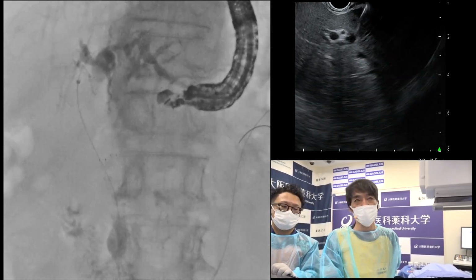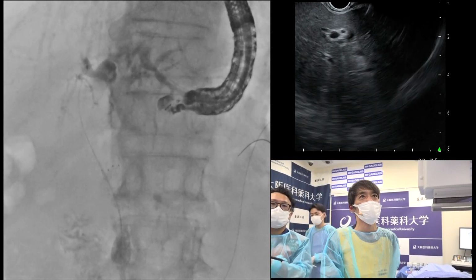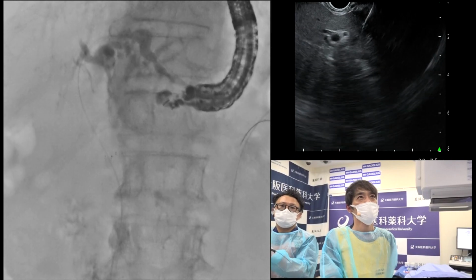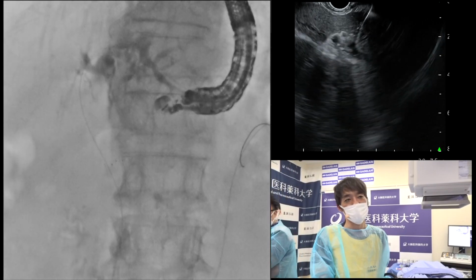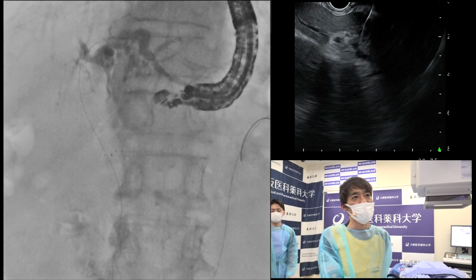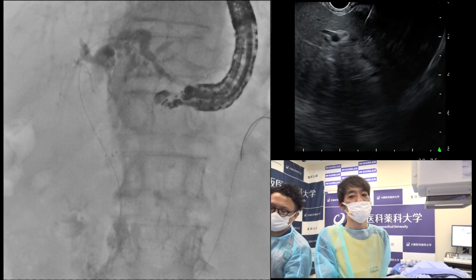Okay, exchange. So next we deploy the HGS stent. Which stent do you use for HGS? The Taiwan? The Teum spring stopper is provided by Teum Medical. By Teum, Teum Medical.